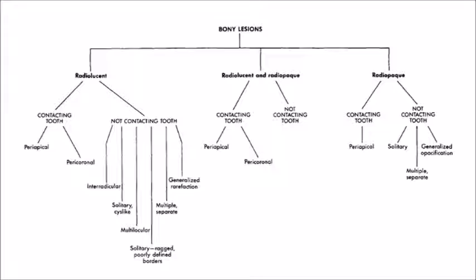In radiographic diagnosis, bony lesions are very important. They can appear radiolucent, radiopaque, or a mixture of both radiolucent and radiopaque. The radiolucent presentation is particularly important.